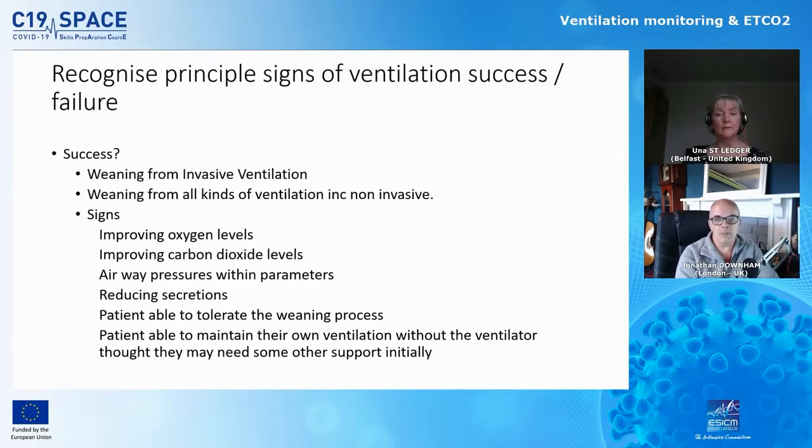Airway pressures are very important. Our ventilators push air in. You and I suck air in, the ventilator pushes air in. So that's positive pressure ventilation. Sometimes the airway pressures can become quite high, especially with the sick lung. The typical COVID patient commonly had very stiff lungs, so the airway pressures required to get air in were quite high. If we can get those airway pressures to come down, and the patient continues to ventilate well, then that's also very important and is a sign that the patient's ventilation is improving.